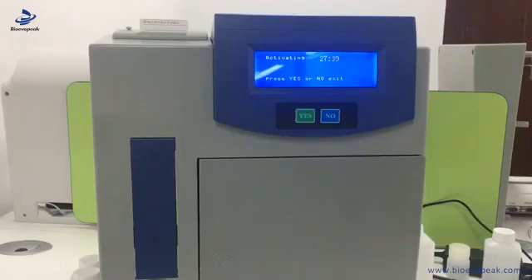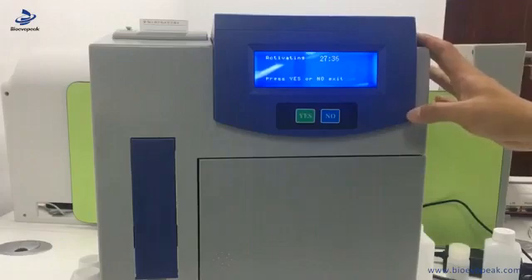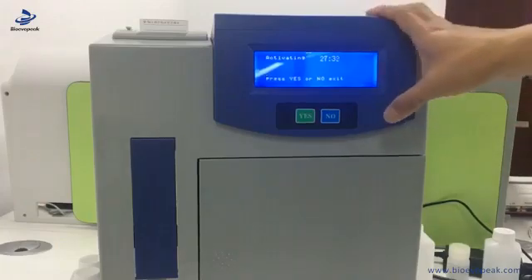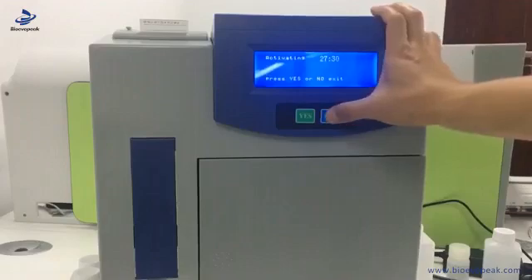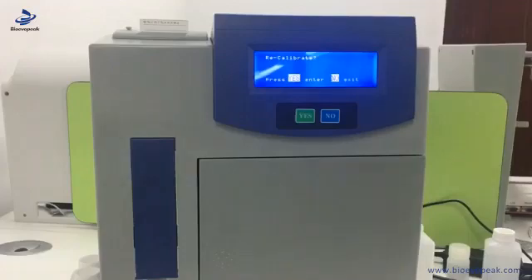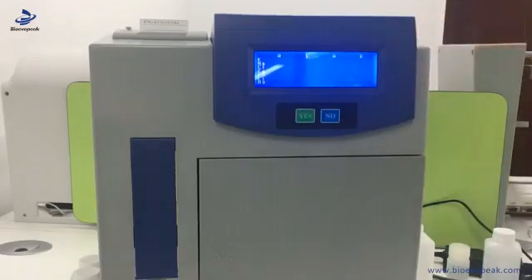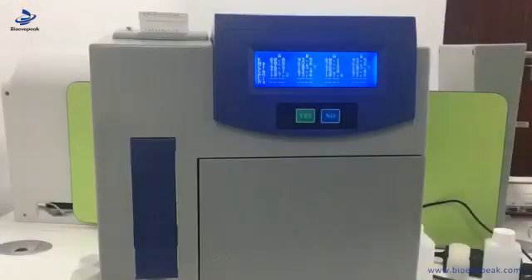So if you don't need it, press no to exit. Then we go to the recalibrate menu page. You have to do the calibration before you run the machine, so we press yes. After a while, it will show you the calibration data.